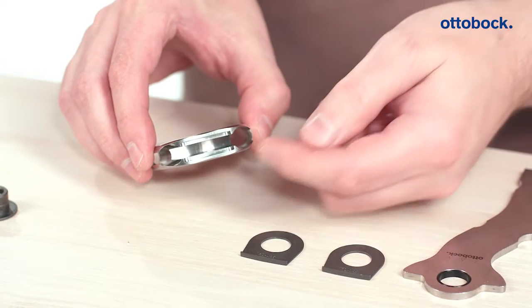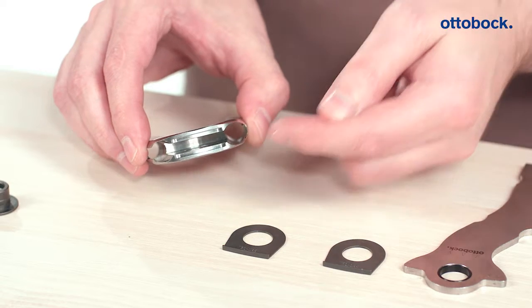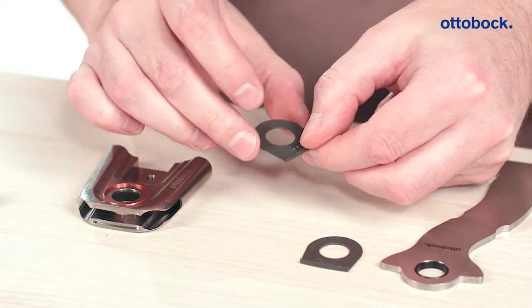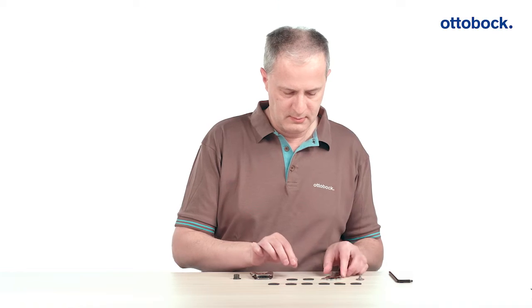Assembling the axial washers is very simple. A rectangular retainer is located on the interior and exterior of the bottom of the joint. The axial washers have a mechanical stop on their undersides. This fits perfectly into the retainer on the joint and ensures the optimum fit of the washer.